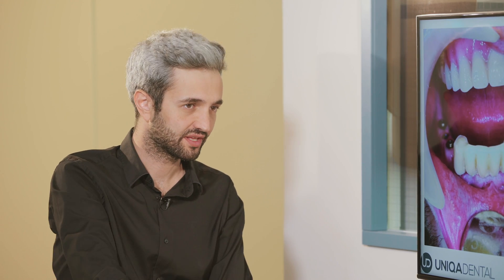He didn't use the partial denture, so what we did is we took both of the canines and made a new temporary bridge, because the old bridge was a little problematic for the implantations. We placed some implants. In this case we want to wait until the implants are osteointegrated. Then we can remove this bridge, extract those teeth, add one or two implants in the frontal area, and make another temporary bridge on the posterior implants. This way the bridge rests on the canines while the implants are getting osteointegrated.